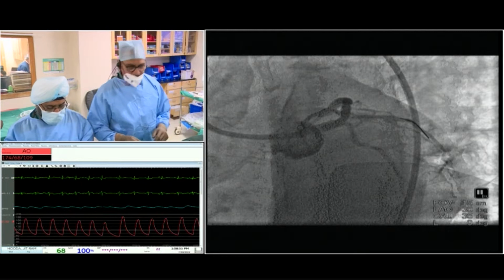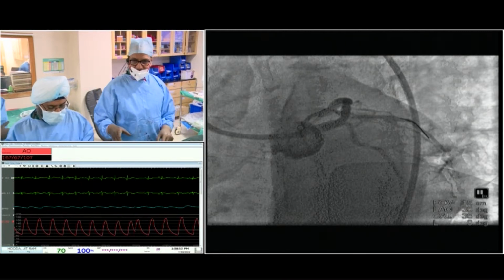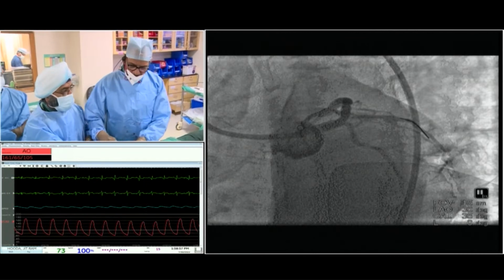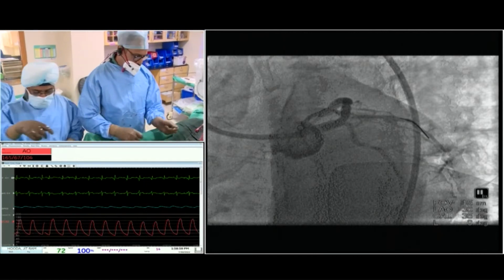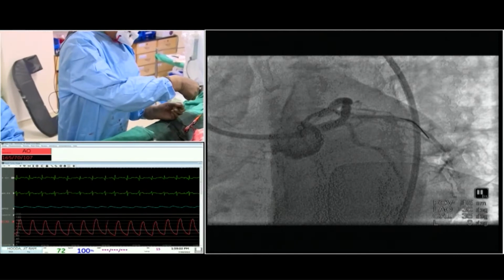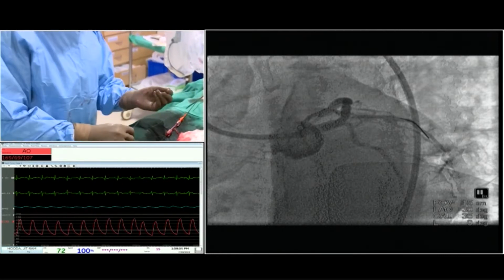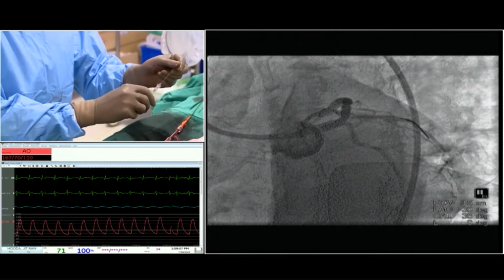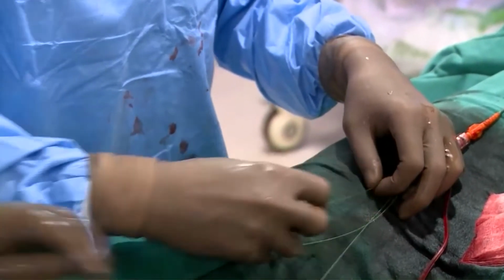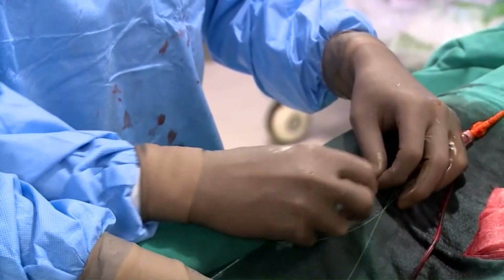Go. The definite indication is, as you agree, there's a stenosis and then also slow flow or some dissection. All that will definitely intervene. Without any of these, it's anybody's choice. But if possible, you try to avoid working too much on the ostial LCX, because that's the commonest area of trouble at follow-up. Antonio Colombo says when you did left main bifurcation, somebody comes back with stenosis, it will be invariably LCX ostium.